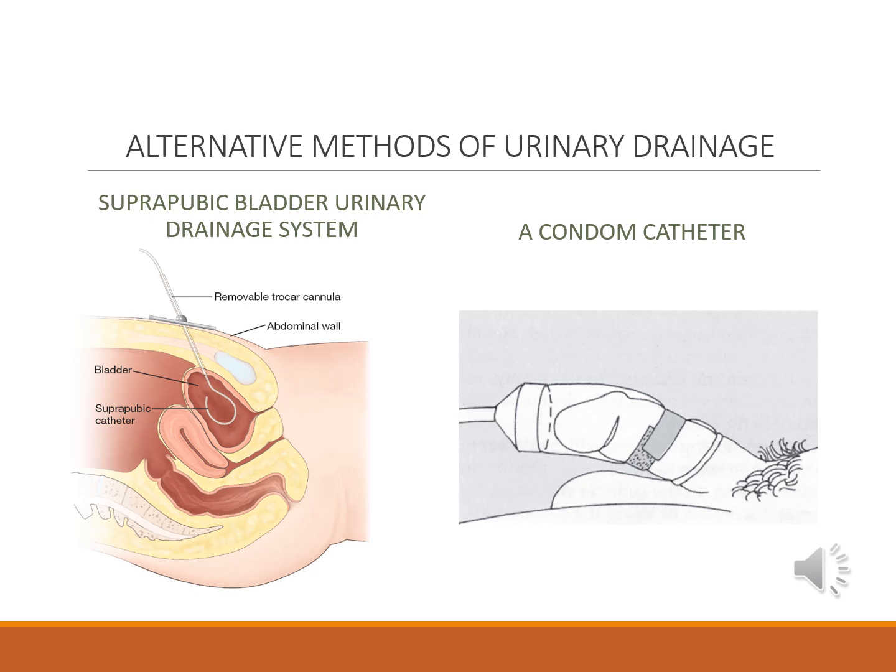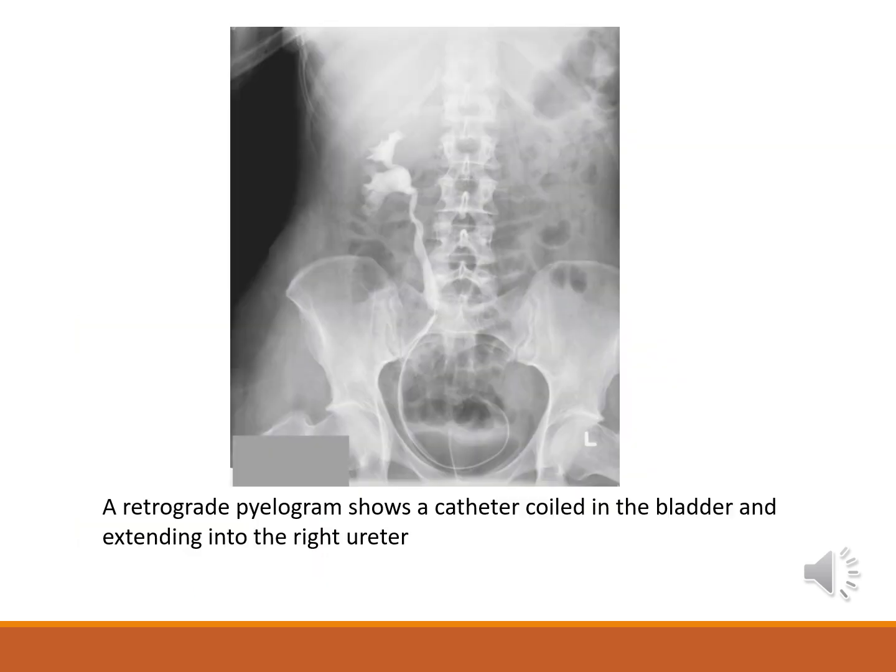When dealing with patients with either type of catheter, radiographers must be cautious not to dislodge or damage the catheter and must respect cultural differences and beliefs related to catheterization procedures. Retrograde pyelography is a radiographic technique used to visualize the proximal ureters and kidneys by injecting iodinated contrast through a catheter inserted into the ureter from the bladder.